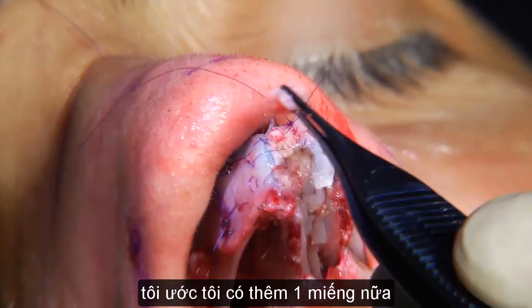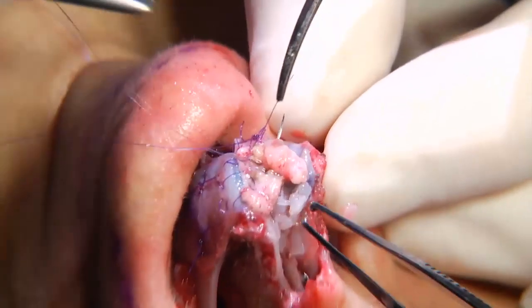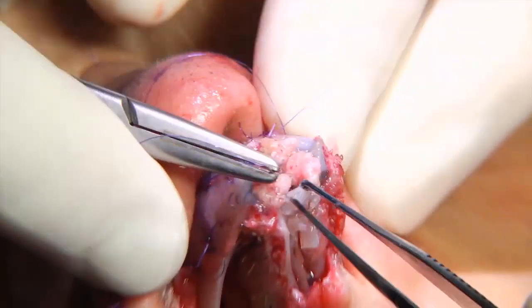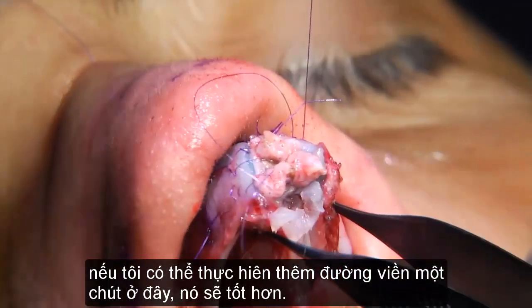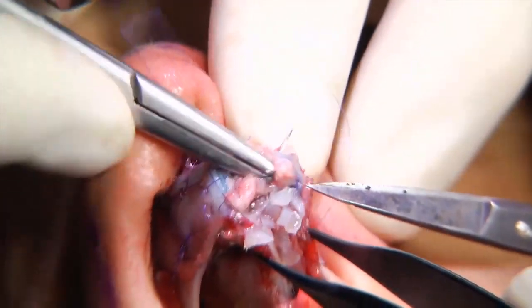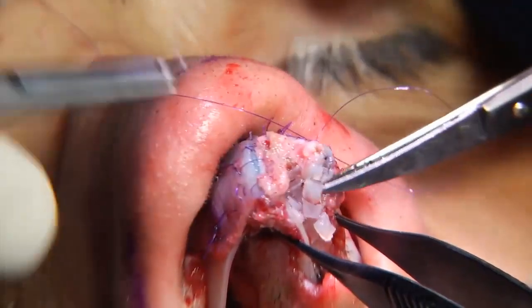I really wish I had an extra piece. Now, if I can get a little bit of a contour here, it's going to be better. Probably it would be a case to take a little piece of dermis somewhere, but I don't want to do anything else to this fellow, actually.